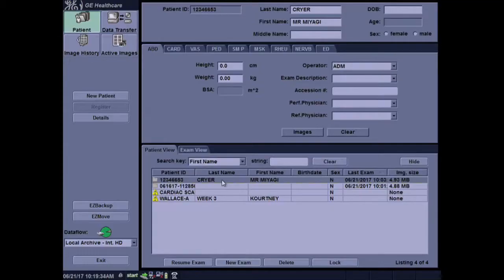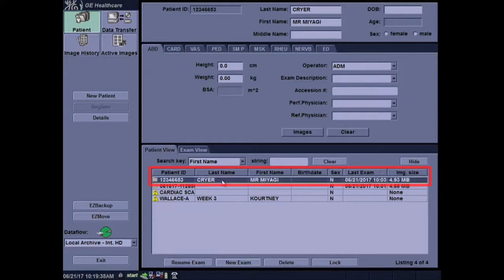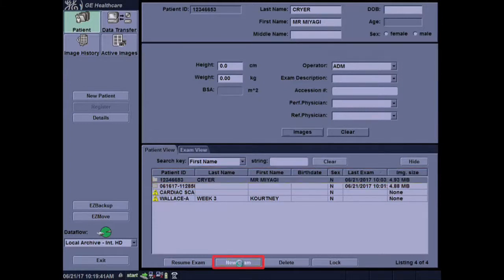I'm going to demonstrate the follow-up tool using a patient that we've previously scanned. I will select the patient view and open a new exam.